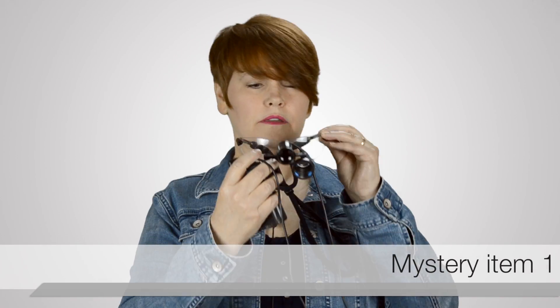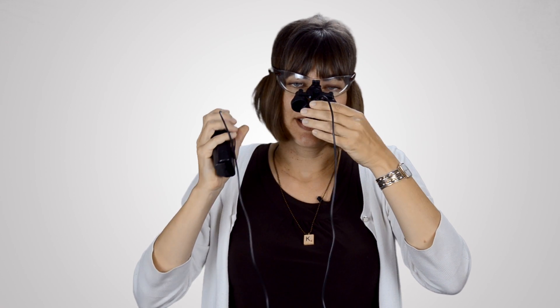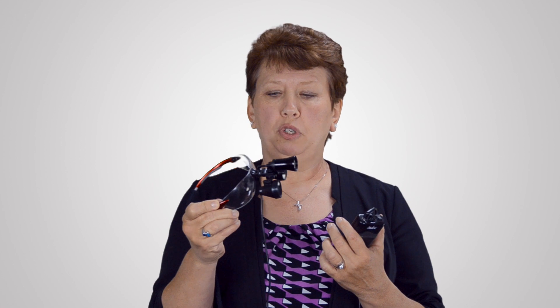So can you guess what this is? I'm getting a Jacques Cousteau vibe. I'm not really sure. Miner's lamp? It is a client compliance enhancer. So when you're talking about your dental recommendations, you put it on like this and then you shine this light into the client's eyes and they get scared and agree to whatever you're recommending. This is actually a set of dental loops that we can use to visualize those little tiny teeth that we see in cats or even in small dogs.